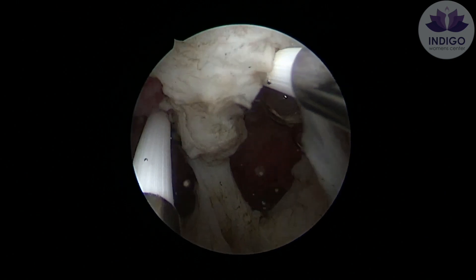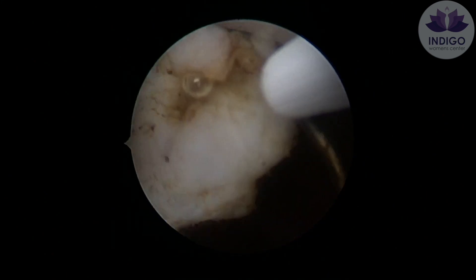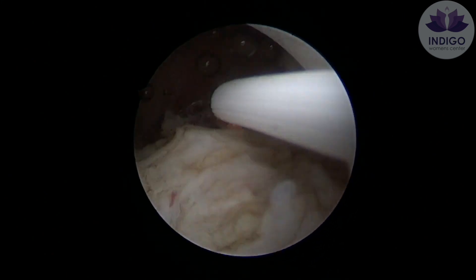In this particular step, you can see me pushing the blade towards the uterine fundus. However, I do not recommend this step to beginners.